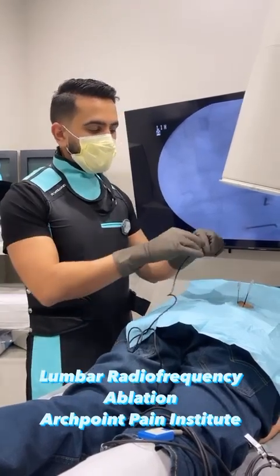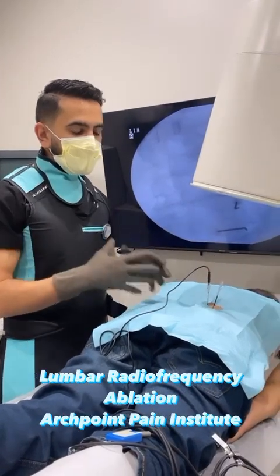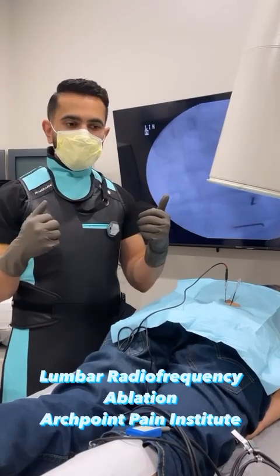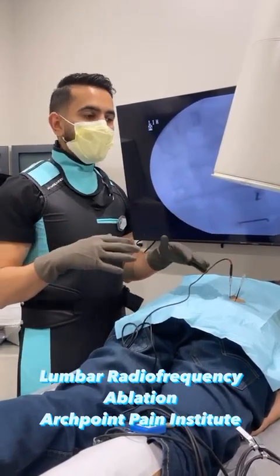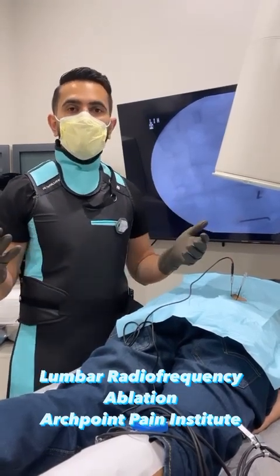So we're about to get started here. We're going to stimulate those nerves and make sure that we're at the right direction and right close vicinity to those nerves, and then we'll get started with heating those nerves up and causing that mechanical disconnection and helping them have chronic pain relief for 9 to 12 months.